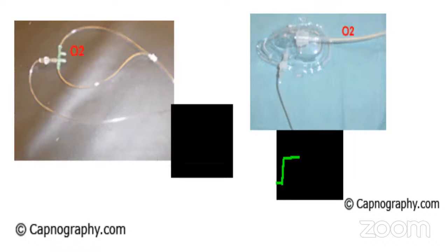Hello sir, the size of the ET tube is about 14 or 16, something like that, so the size of the connection. You need that much size to connect, kada? For mainstream, sir? No, for ET tube or any connections, you need connections, kada? Sir, but I think we can use it for all the endotracheal tubes, sir. For endotracheal tube, we'll connect the filter, no? There is one port. Sometimes that port will be disconnected, no? That cap will be dislodged and get a leak. So that is for ETCO2 monitoring.